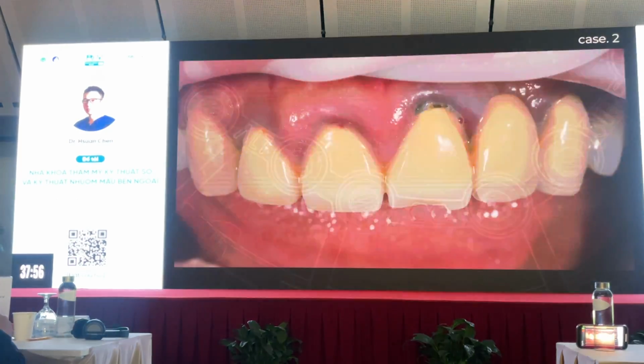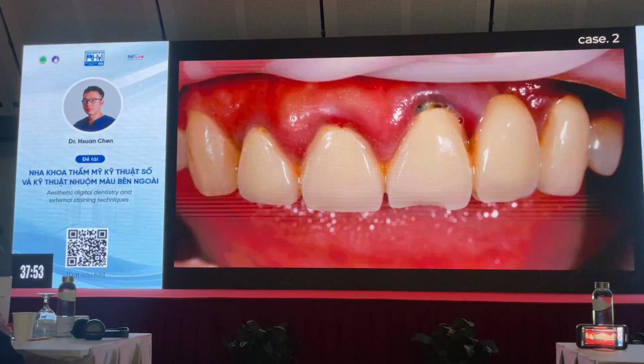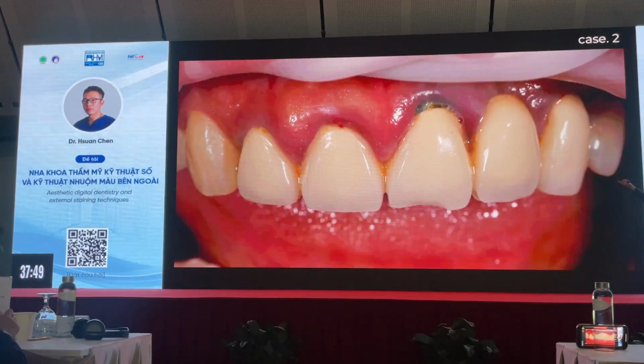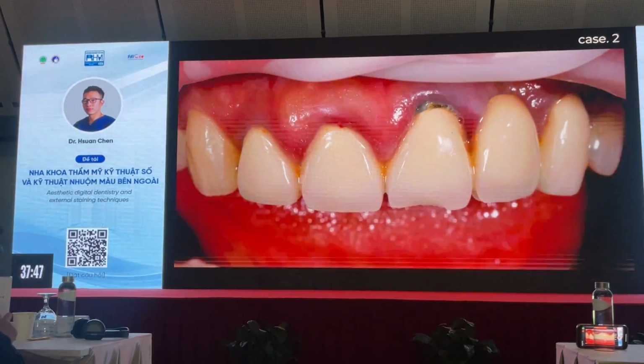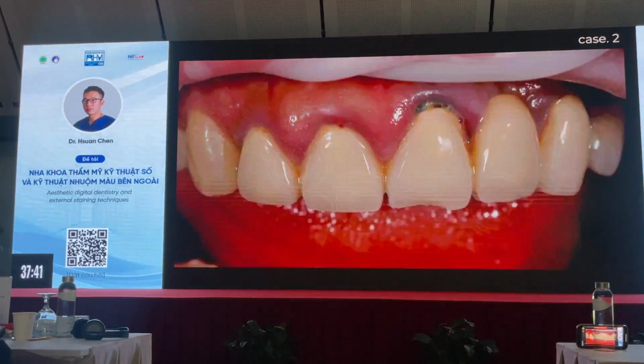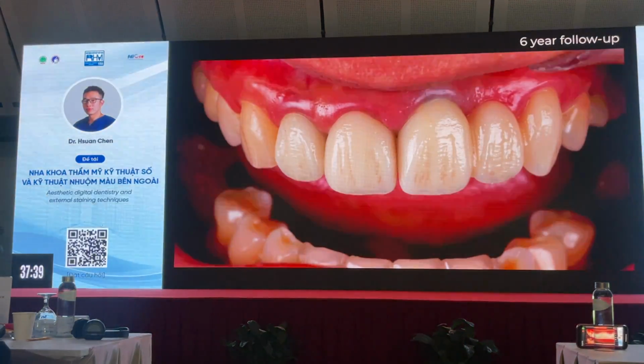So this is an implant case. Today we're not talking about implants, so I want to skip this very, very quickly. But this patient came in 6 years ago, I think. And so, long story short, we did a chairside dentistry for her, and then 6 years later, she came back. Everything is still looking okay, but there's some stains. Now, I want you to notice that she has a bridge on tooth number 22. So that is the pontic.